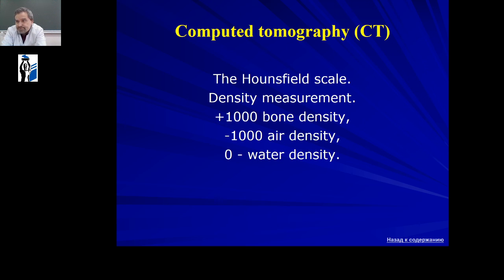Why we have different view of some organs and pathological objects in computer tomography. It's realized by density measurement. Density measurement used in Hounsfield scale.